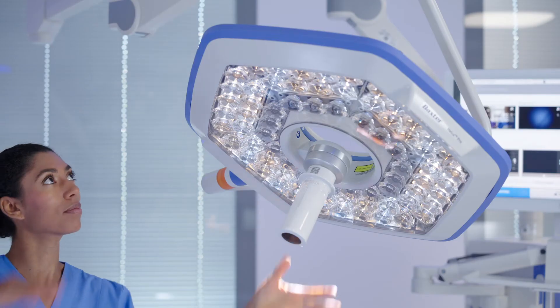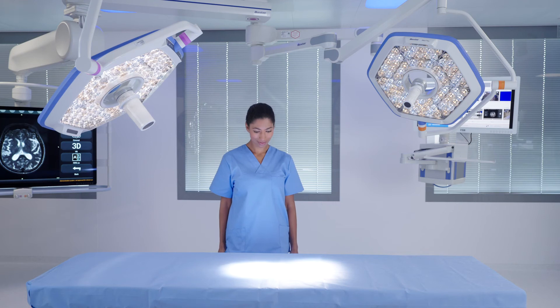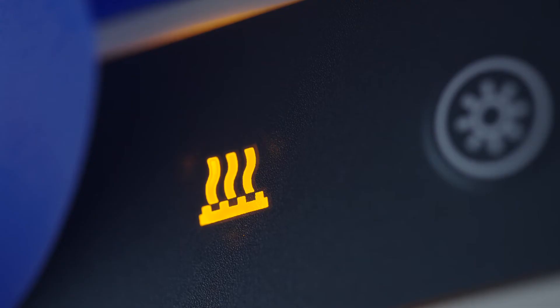The recommended action to decrease light intensity is to change the position of the light heads to ensure the light head patterns are not overlapping within the surgical field. The light intensity indicator will remain illuminated as a visual reminder to the surgical team while both light heads are set to an intensity of 80% or higher.